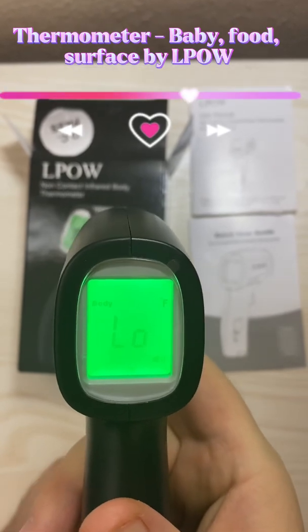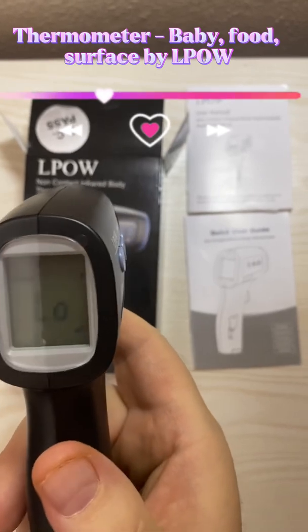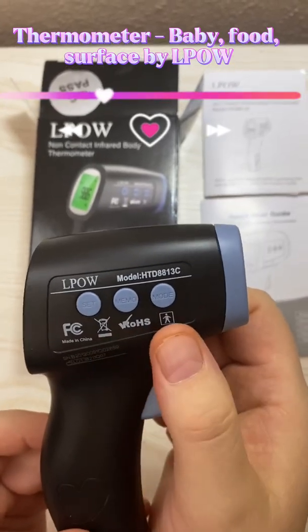This can be used to measure liquid surfaces and body temperature. It can store up to 50 readings. You have three buttons on the side here: set, memo, and mode.